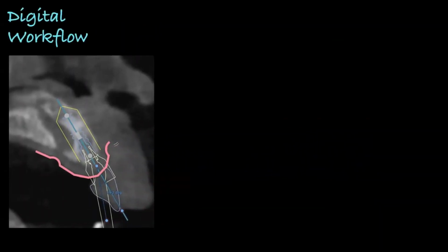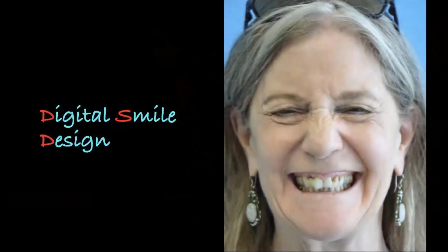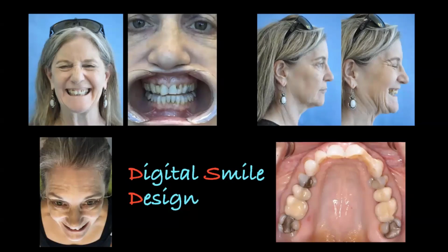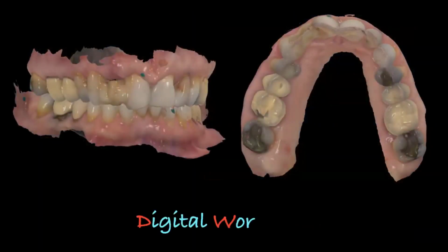And in the end, we can even take it one step further in our communication. We can take all this technology and amalgamate it, and then plan things that include facial scanning and someone's face. So see a case like this where there's the same iOS scan I just showed you. The patient walked in, and we take our images. The reason why these images are specifically sized this way is because they're taken with a phone. Then we take an iOS scan, or a regular impression. It doesn't have to be a digital impression, it could be a regular impression.